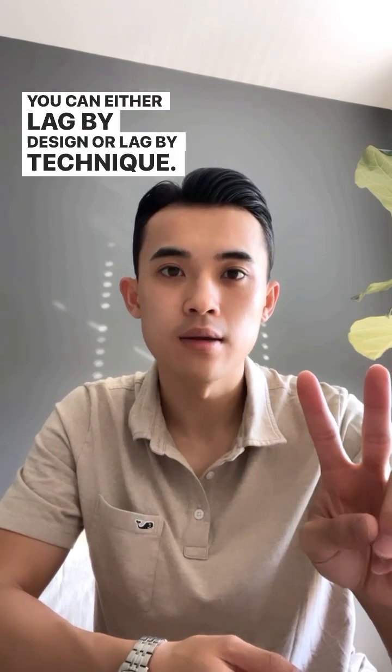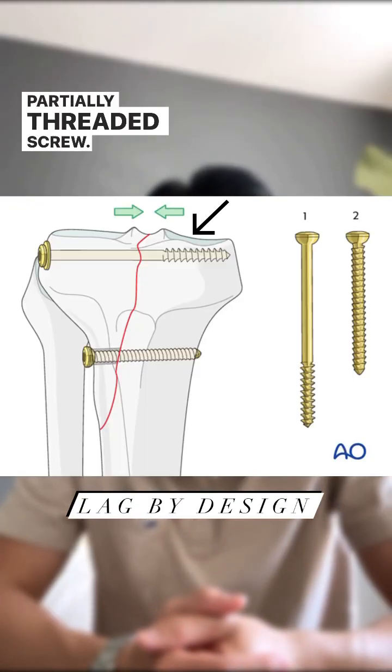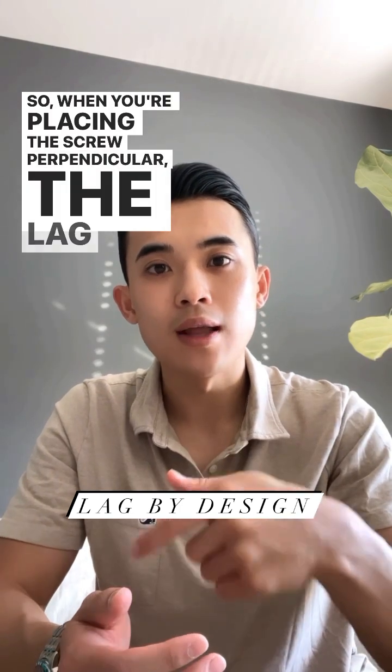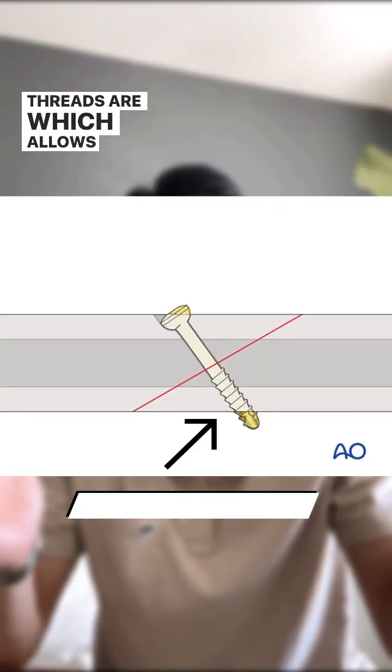When you lag by design, you're typically using a partially threaded screw — the screw only has threads on the distal end. When placing the screw perpendicular, the lag screw will only bite the far cortex, where the threads are, which allows for compression across the fracture line.